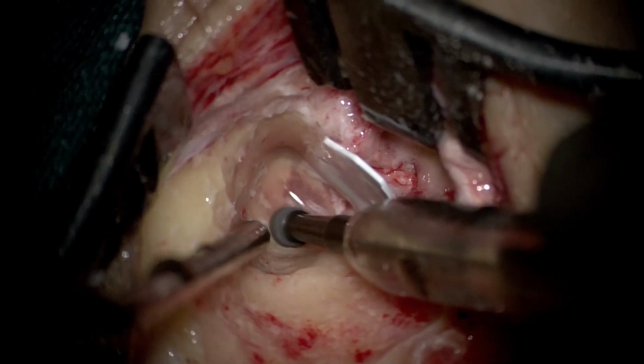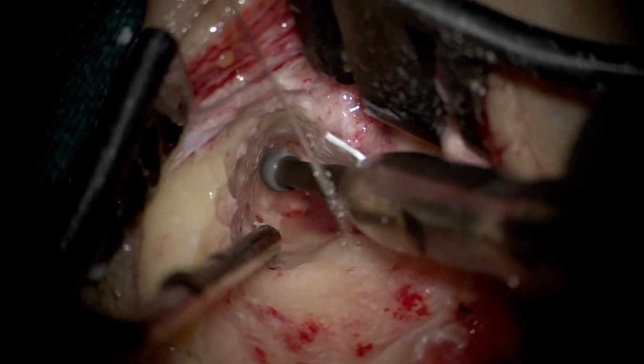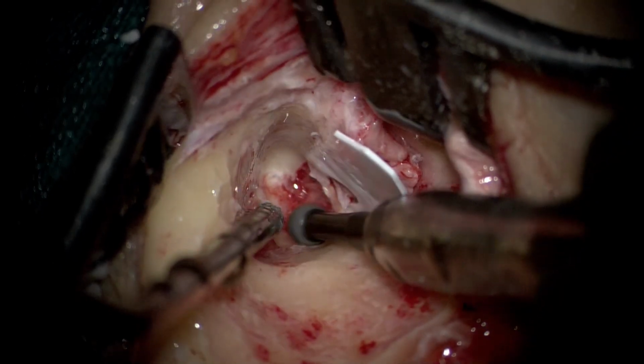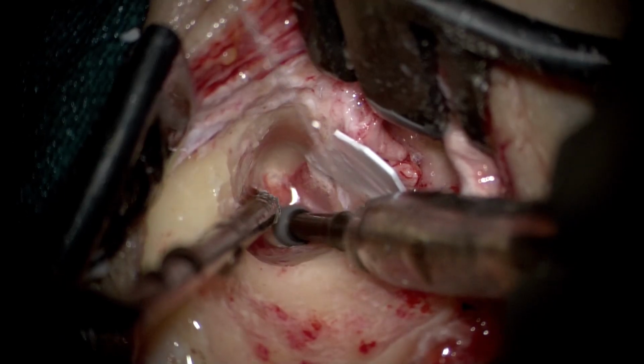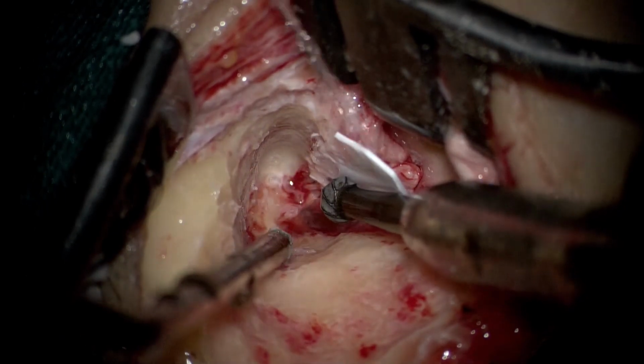You can already see the cholesteatoma flakes in the shadow of the epithelium coming on as we drill the attic further and further. And it is not surprising to see even small cholesteatomas sometimes leading to labyrinthine fistulas and causing permanent hearing loss.